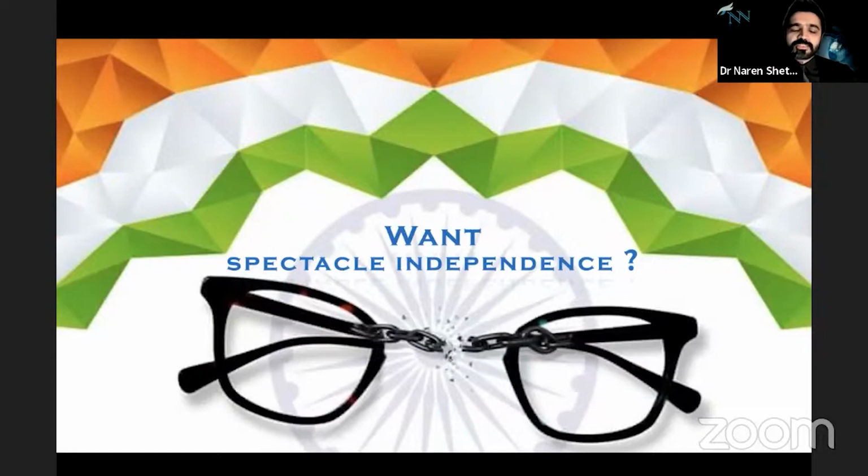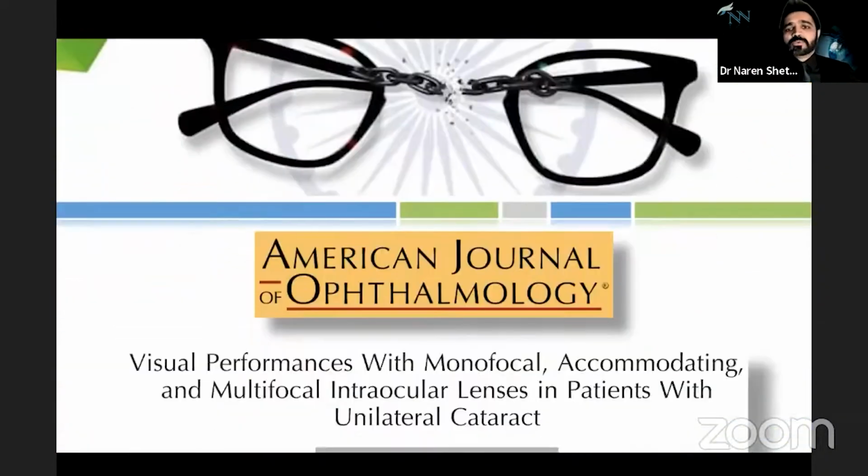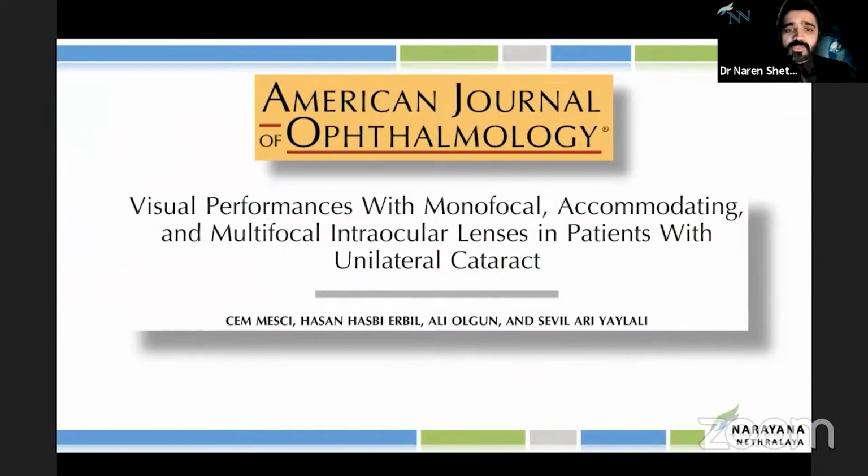First and foremost is, does the patient want spectacle independence most of the time? It's a simple question, and the answer also is pretty simple. Obviously, everyone would want spectacle independence most of the time, that is, if the money is not a factor. Now, the next thing is, let's look at the literature, what is already published.